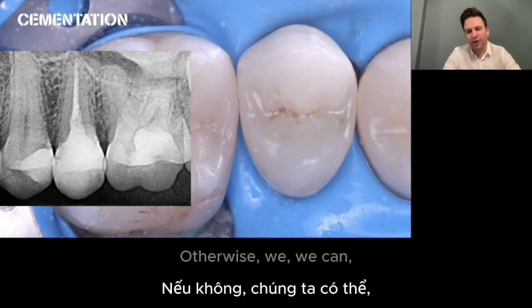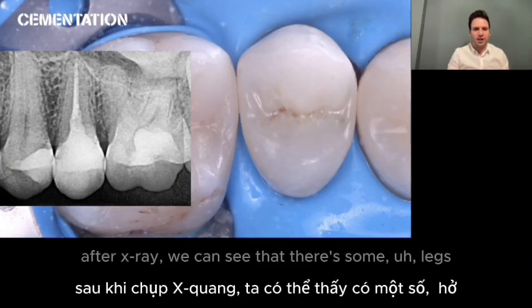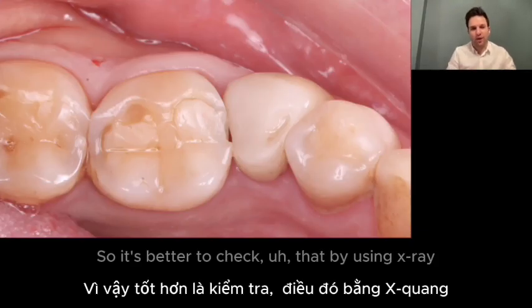Otherwise, we may see the restoration looks fine, but after X-ray we can see there are some leaks or some gaps between the restoration and tooth surface. So it's better to check that by using X-ray.